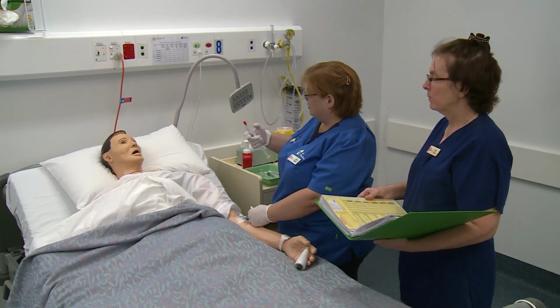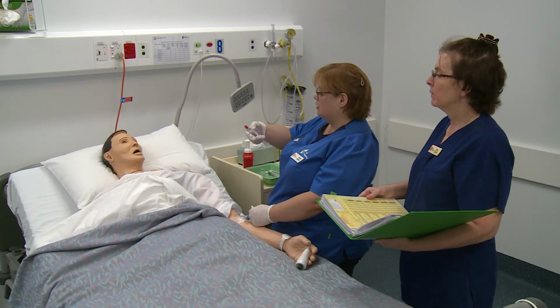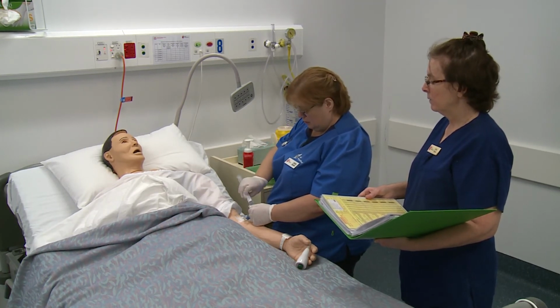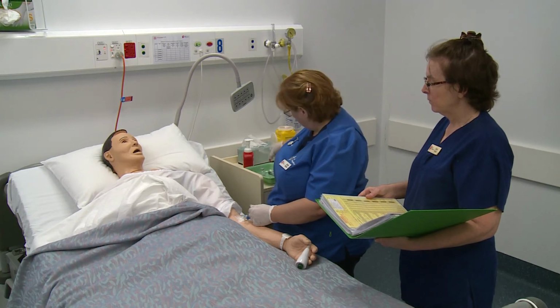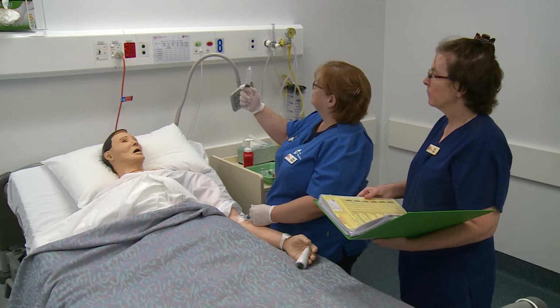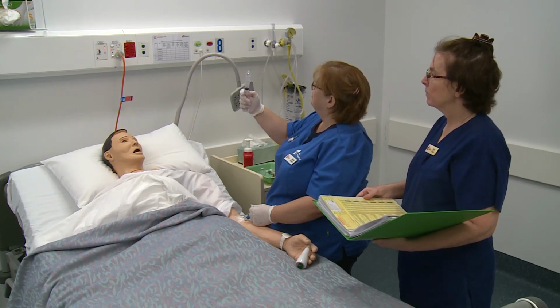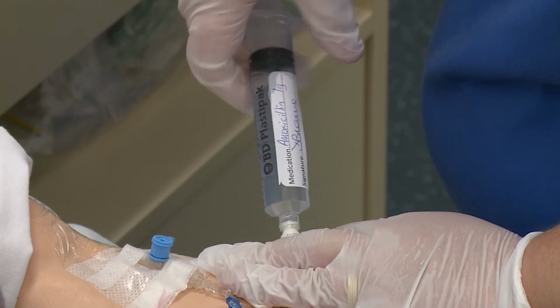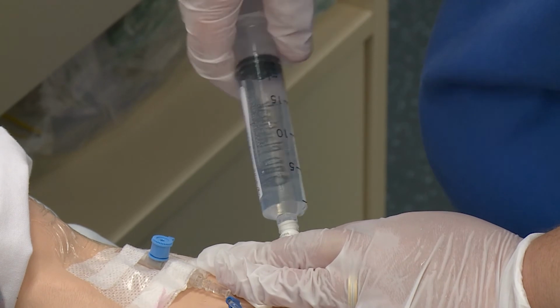So now I'm just going to give you your medication. That's amoxicillin 1 gram. Take my red cap off. Make sure I've got no air bubbles in here. And now I'm just going to give this very slowly.